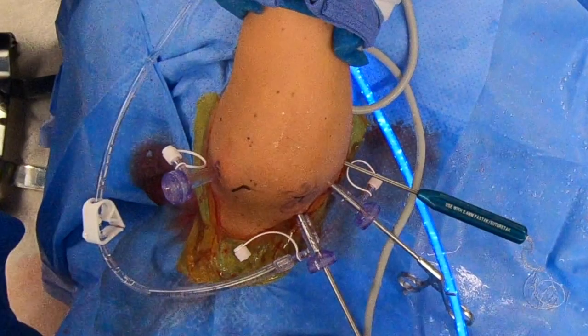You'll see the surgery performed arthroscopically. You can see I've already established our portals. You can watch my arthroscopic labral repair video, which shows how to establish these portals and that portion of the procedure.